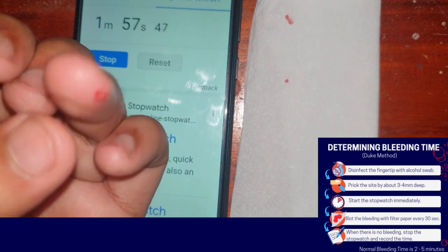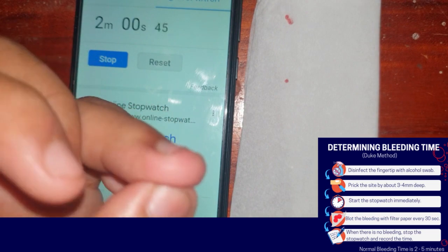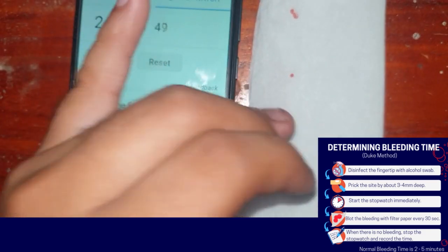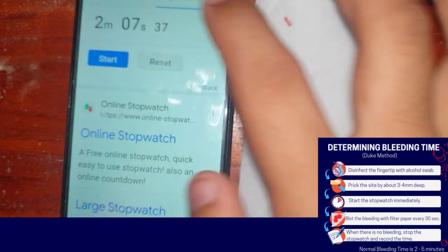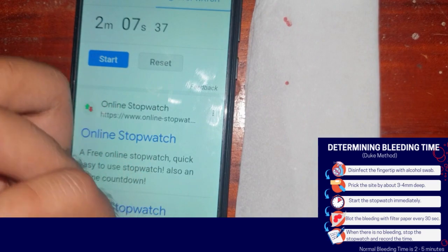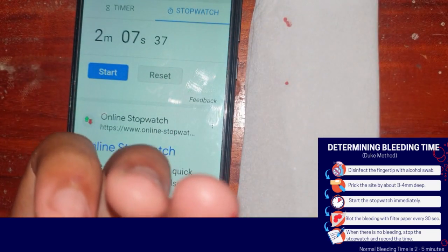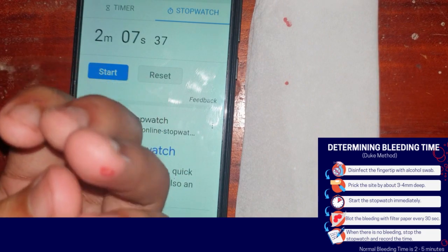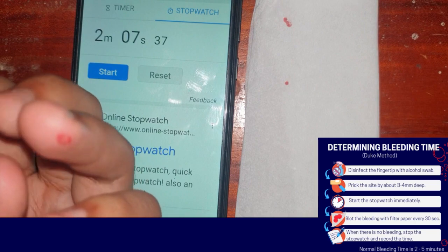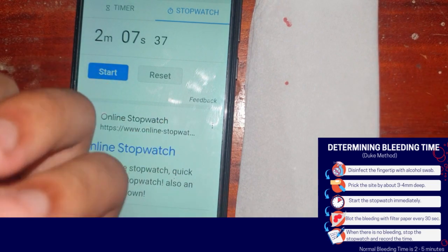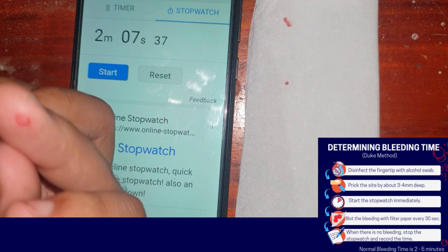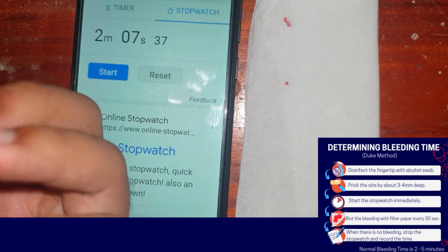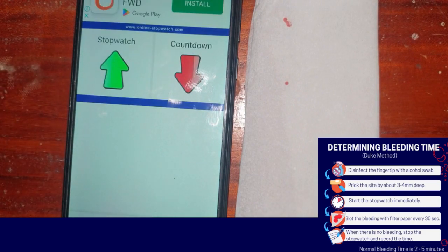We will stop if the bleeding stops. Another 30 seconds. As you can see, there is no bleeding on the paper — that's how we measure our time. We measure the time as 2 minutes, the closest 30-second interval at which there is no blood on the wound. The platelets have successfully formed a barrier in the skin to prevent further bleeding.